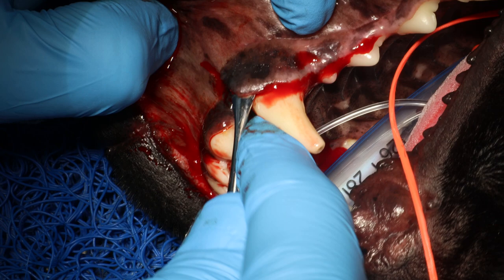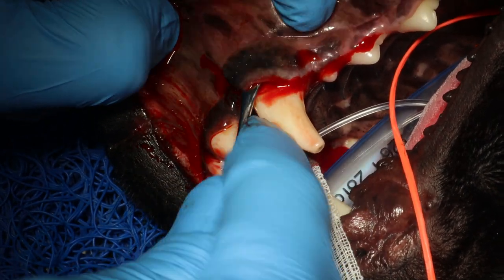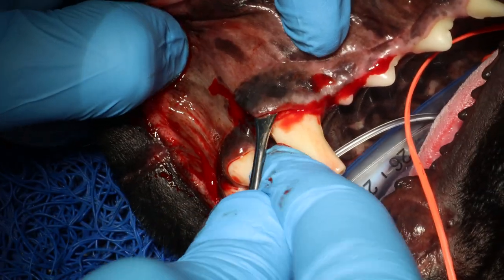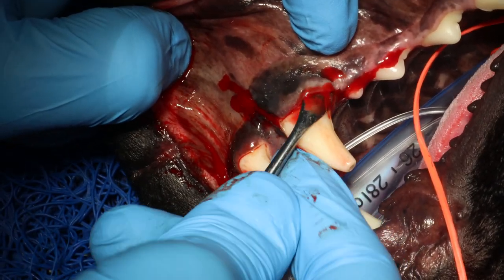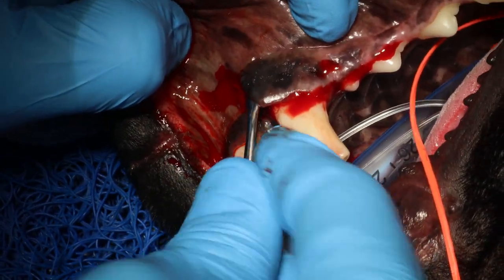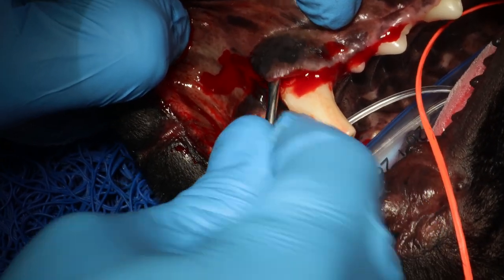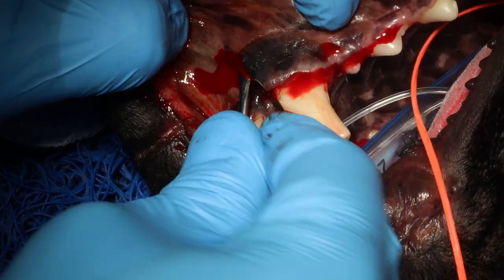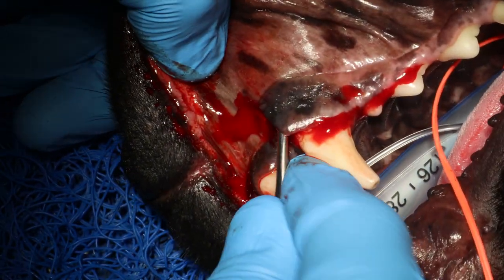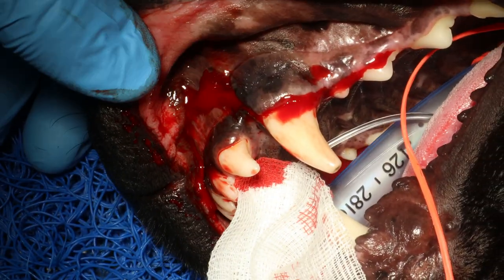The place you should be careful is at the mucogingival line, where the gingiva meets the mucosa. That's where there's a risk of poking through or penetrating the flap. What I like to do is go underneath here and then move sideways, working my way back — you can see the periosteal elevator is up underneath the mucosa.